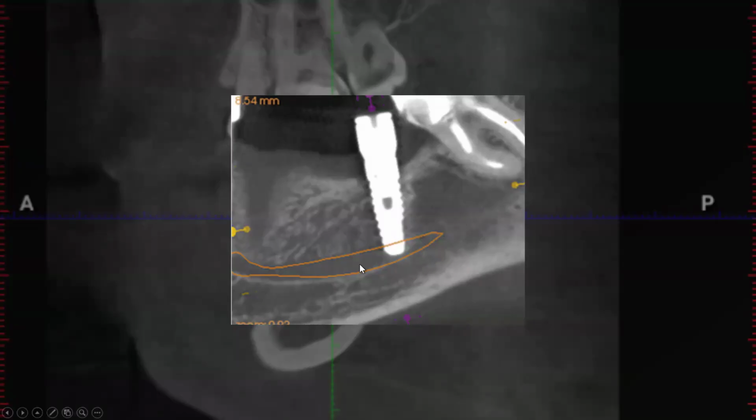And maybe more anterior toward the mental foramen, you can see the nerve canal again. And then you kind of connect the dots, because nerves are not known to really change direction like that, up or down. And so you can get a fairly high accuracy, likelihood, I would say, of where that canal is, even if you don't necessarily see it right in the area of the implant.